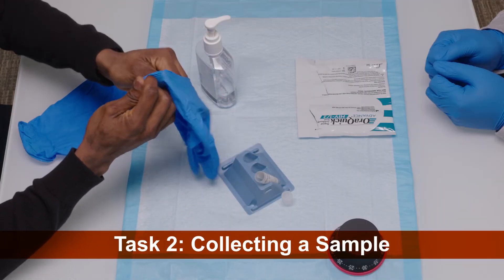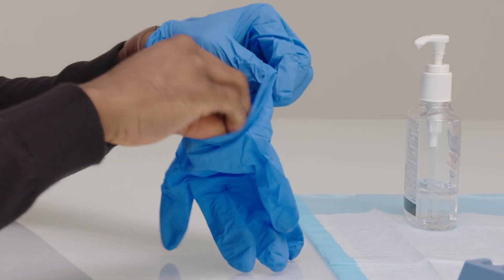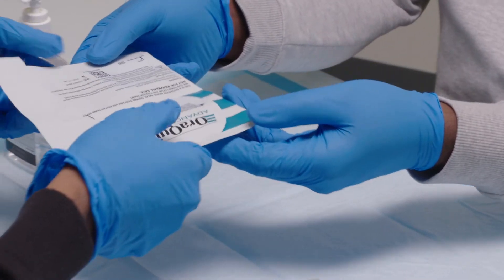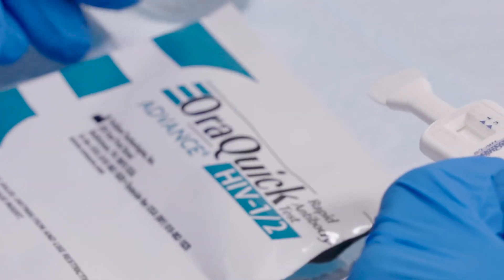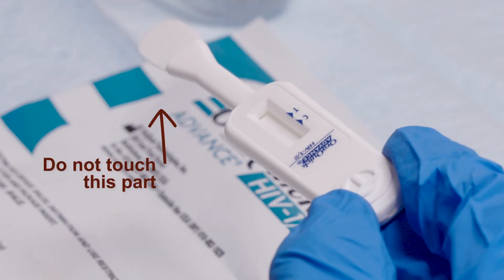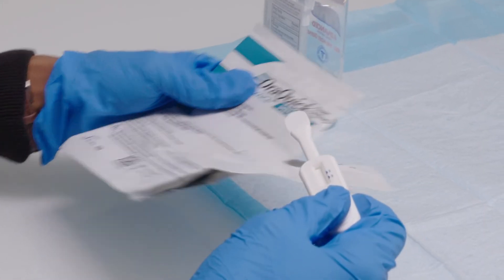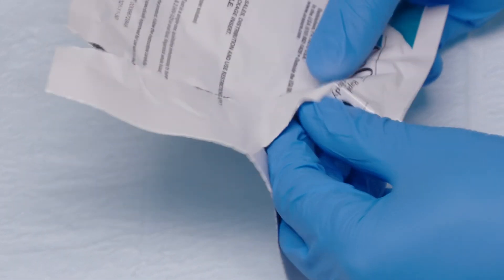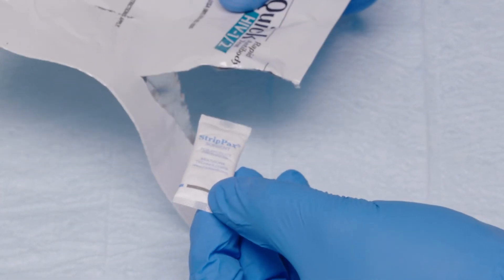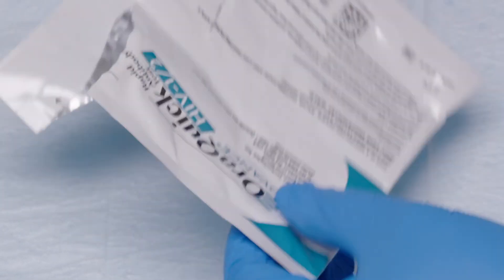Once you have prepared the client and the workspace for the test, the sample may be collected. Have the client put on disposable gloves and hand the open pouch to them. Ask them to remove the test device from its pouch, and instruct them not to touch the flat pad of the test device with their hands. Once the client removes the test device, have them hand back the test kit pouch. Take the pouch and feel for an absorbent packet in it. If the absorbent packet is missing, discard the test and start over with a new test. If the absorbent packet is present, begin with the test.